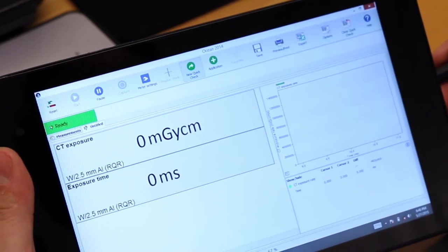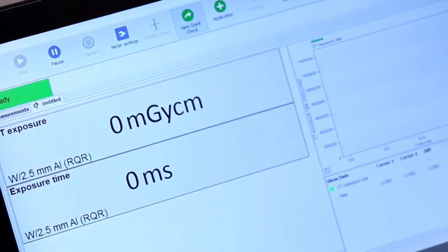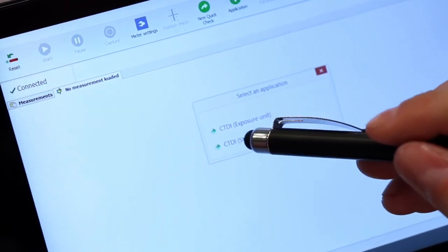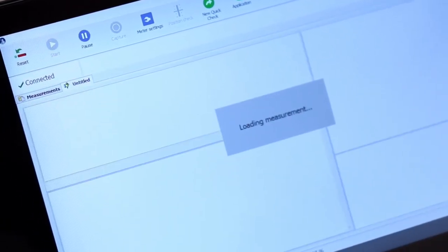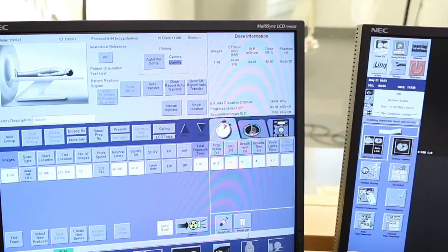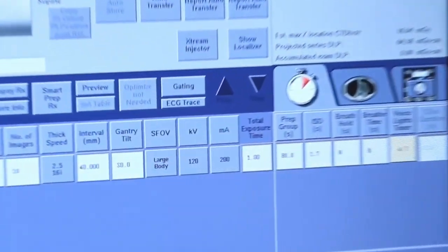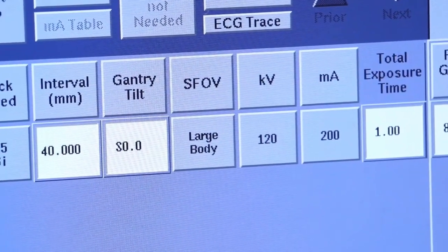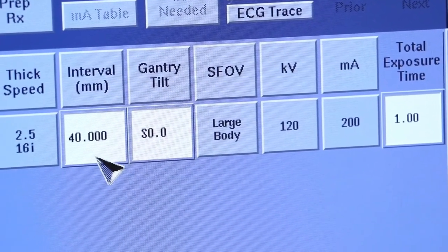To prepare Ocean for CT-DI measurements, tap application and choose CT-DI standard. Make sure that the set values — kV, mAs, slice thickness and number of slices in Ocean — match the values you have set on your CT machine.